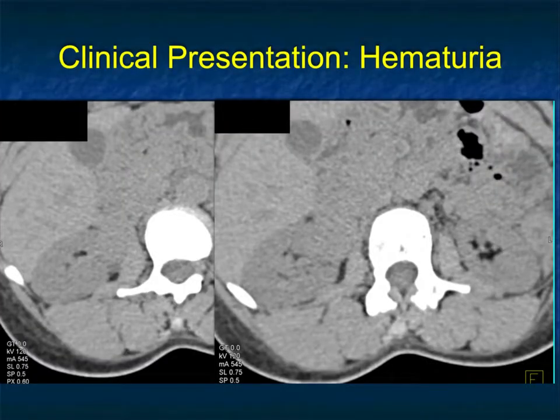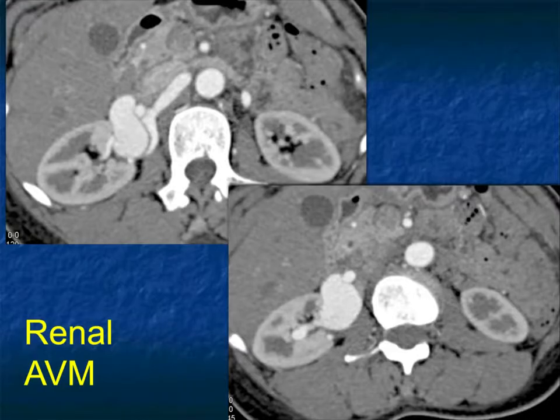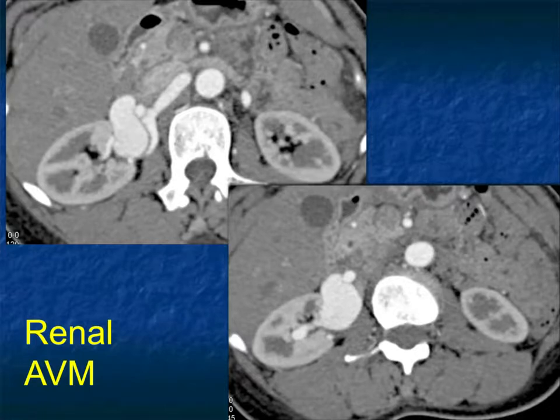One of the challenges with non-contrast CT is that you don't see the vessels, so things like AV fistula, aneurysms, and renal vein thrombosis can be missed. In this patient with hematuria, on non-contrast you don't see anything obvious — maybe a slight difference in fat in the hilum. But when you give contrast, you see a beautiful example of a renal AV malformation. Vascular processes are not that common, but they do occur, and contrast is essential to see the findings.